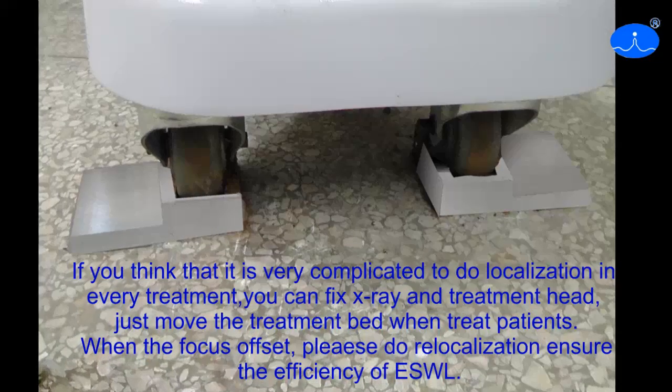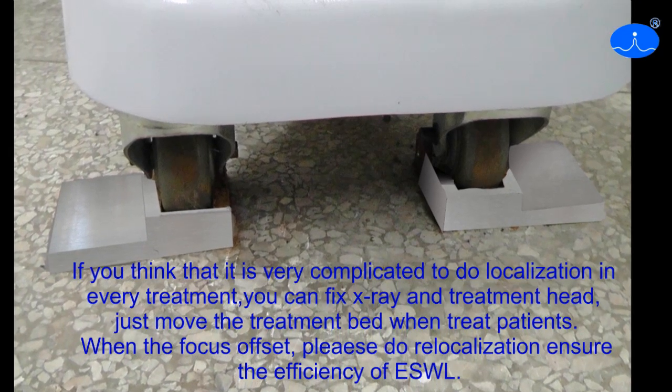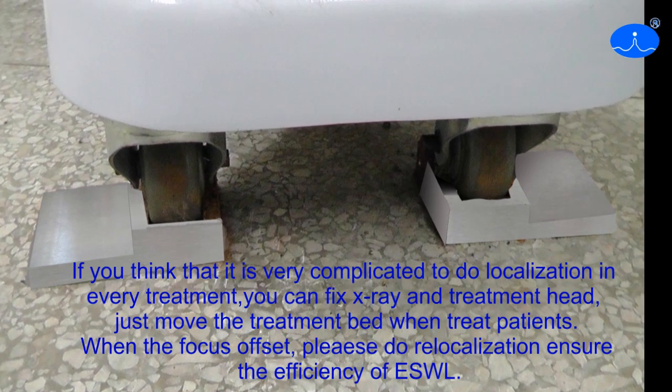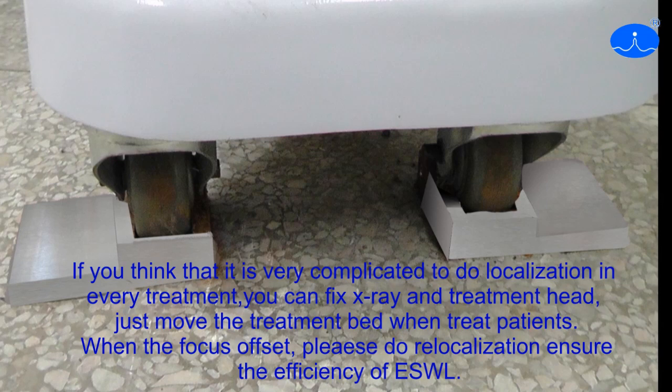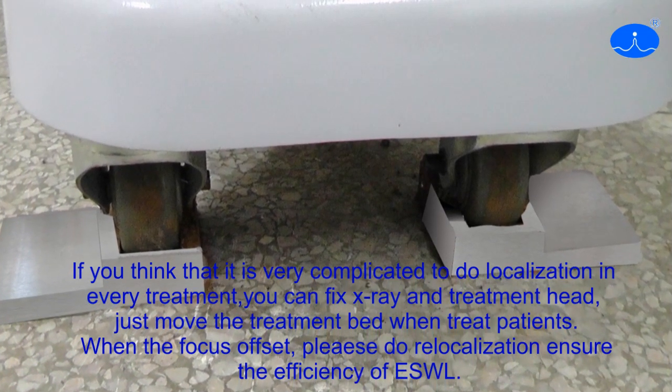If you think it's very complicated to do localization with every treatment, you can fix the X-ray and the treatment head — just move the treatment bed when you treat patients. When the focus offsets, please do relocalization to ensure the efficiency of ESWL.